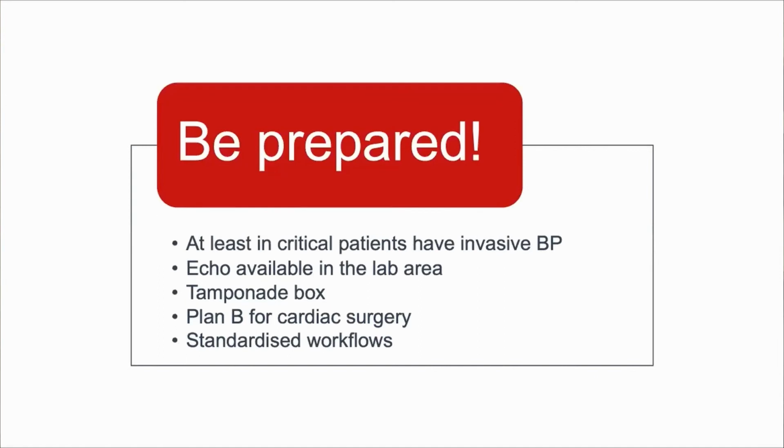Be prepared, at least in critical patients: have invasive blood pressure monitoring, echo available in the lab area, a tamponade box, a plan B for cardiac surgery, and standardized workflows. Everything for early detection of complications and early treatment procedures to save patients' lives.